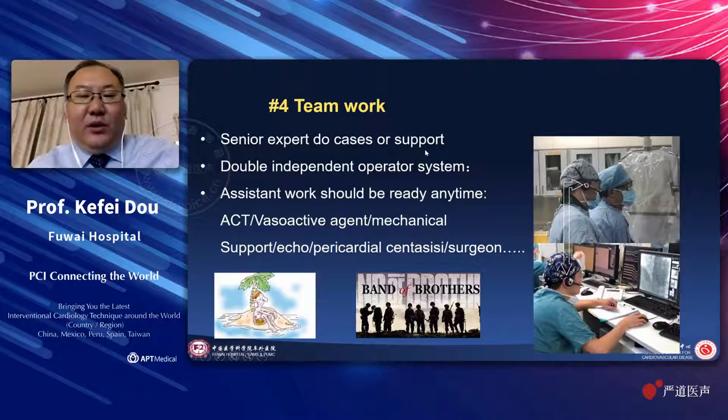In my team, we always use a double independent operator system. You can see these two guys are two younger independent operators, and they use earphones to communicate and to talk about the cases. And then they support a very young doctor to do the CTO cases. Based on this teamwork, they improved together and improved very rapidly.